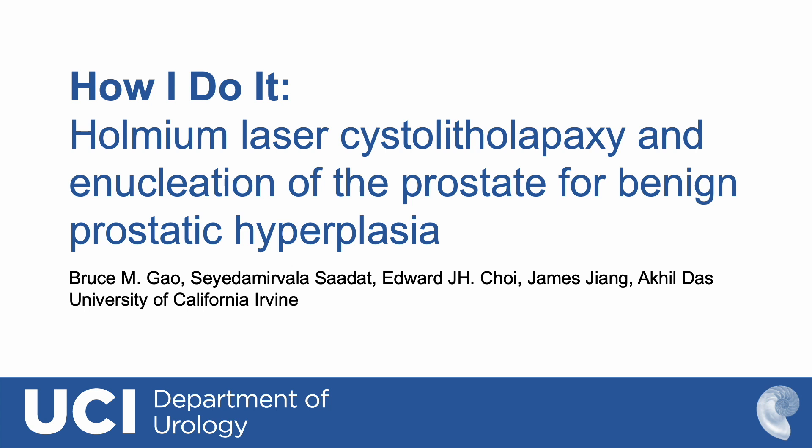Holmium laser cystolitholapaxy and enucleation of the prostate for benign prostatic hyperplasia.